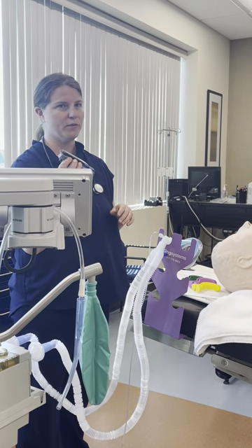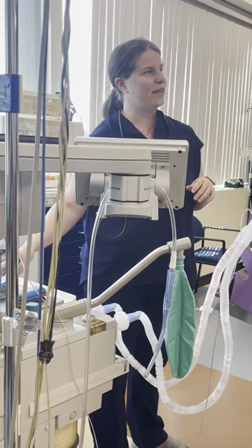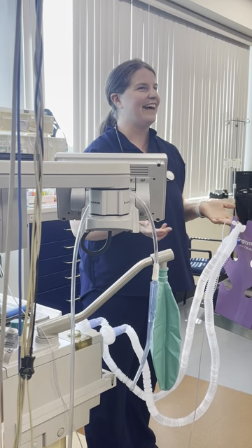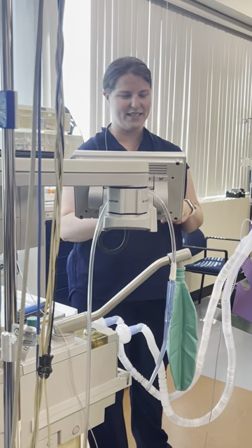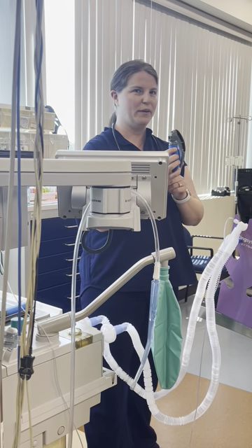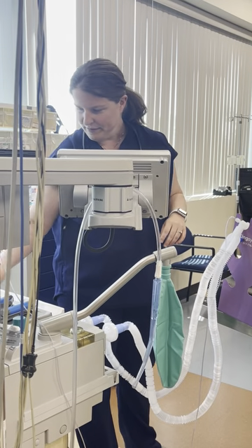There's a difference in where you place the blades. In practice, many people use the MAC-4 blade as a Miller blade. That is not how it's designed technically, because then you're placing a lot of pressure on the epiglottis with the tip of the blade because it's curved. But you'll see it — you'll see it plenty.